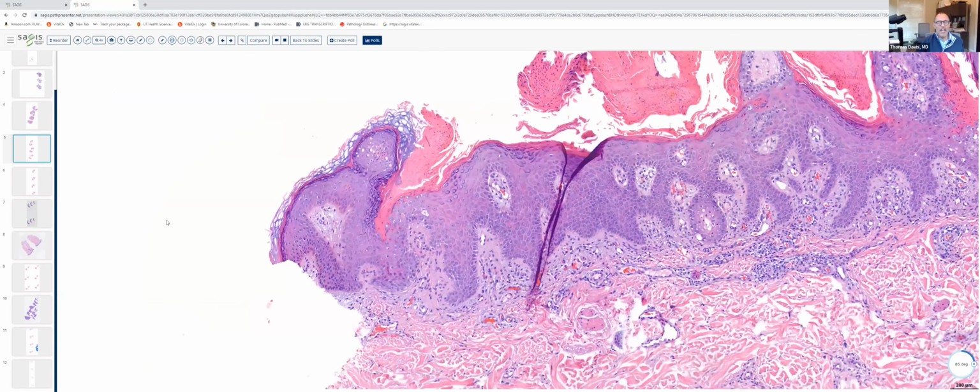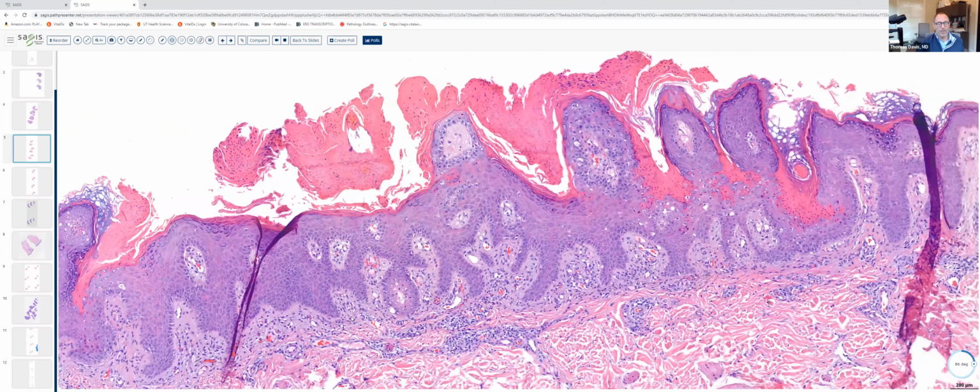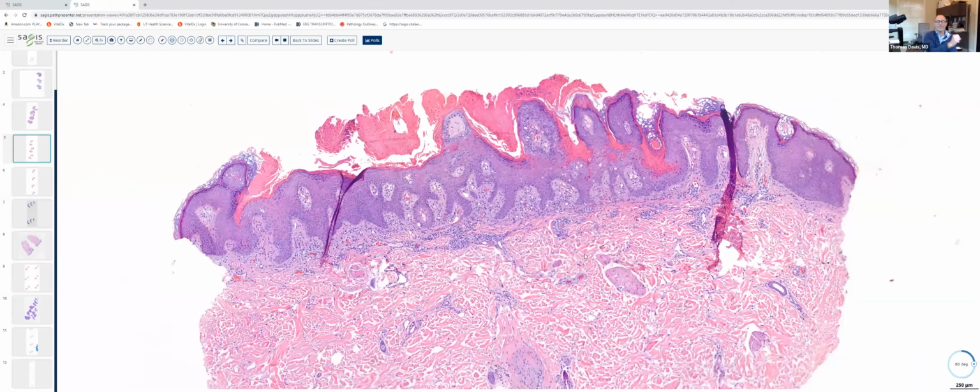So we have this hyperplastic epidermis that is papillated with an inflammatory infiltrate and several discrete cornoid lamellae across the biopsy specimen. And this constellation of features is very characteristic of a variant of porokeratosis that tends to produce papules and at times very large plaques in the genitocrural area, especially over the buttocks. And this is Porokeratosis ptychotropica.